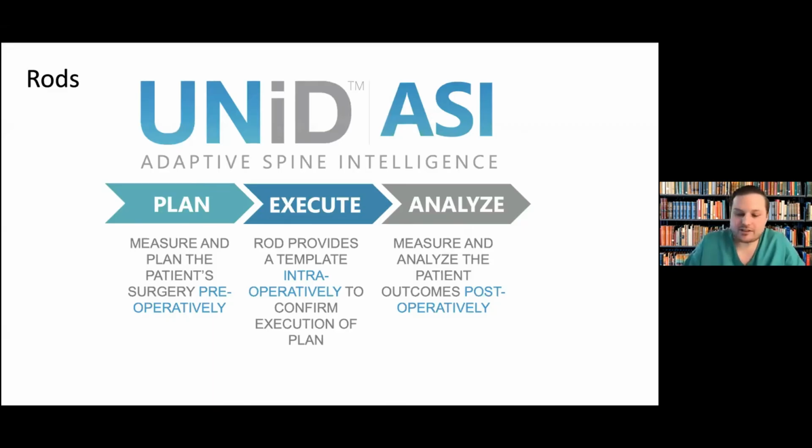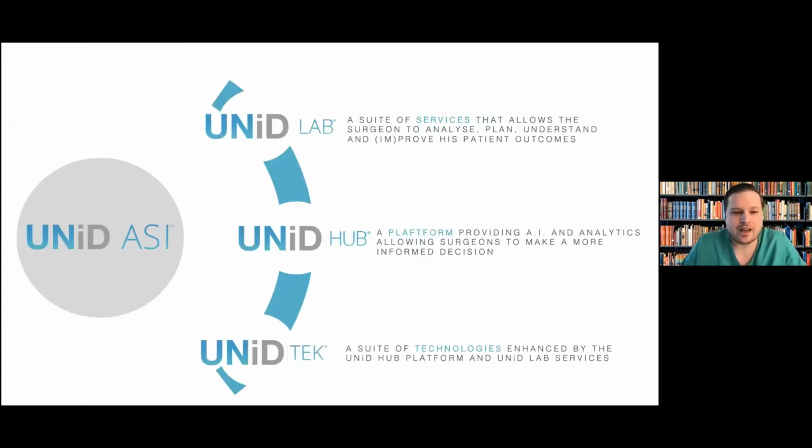Lastly, I wanted to just discuss patient-specific rods. This is a company that I've used in the past, and we've published some papers together. The group has biomedical engineers that can take your scoliosis X-rays and develop the plan on their own and send it to you for approval, or you can create the plan yourself.